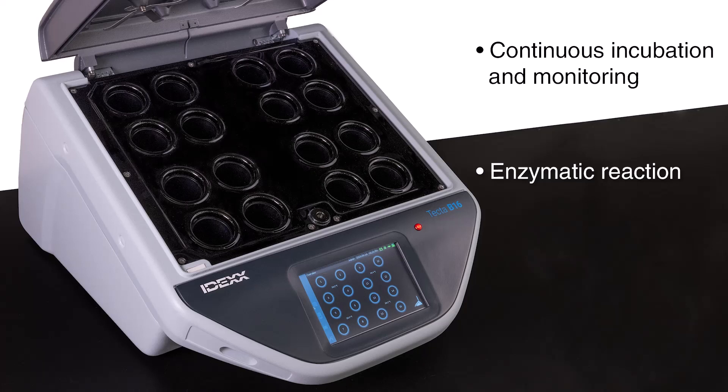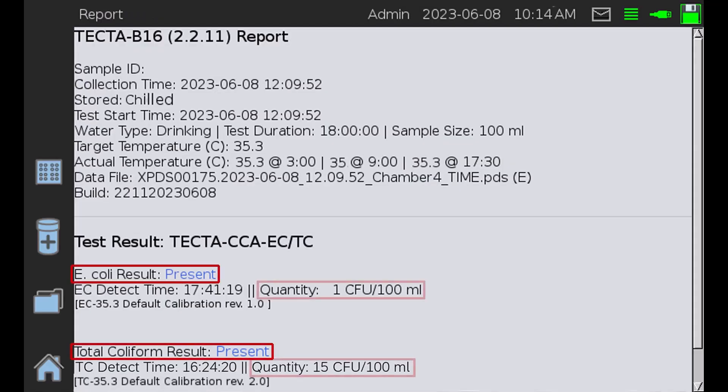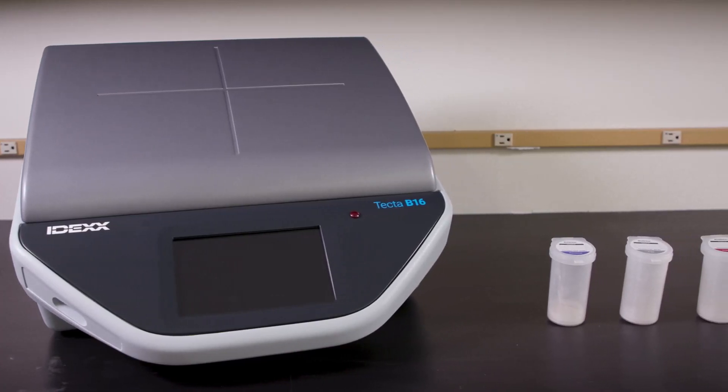When a fluorescent signal is detected by the optical sensor, the instrument immediately reports a positive result to the user. Results are reported as both presence/absence and quantification on each test, and offer a counting range of less than 1 to 10 to the 8th colony forming units (CFU) or most probable number (MPN) per 100-milliliter sample.